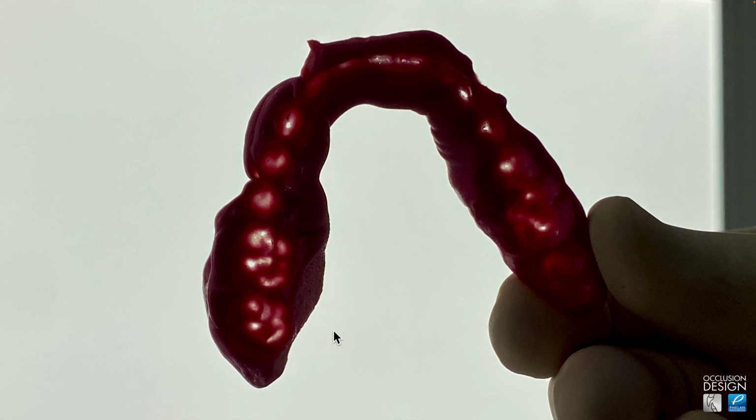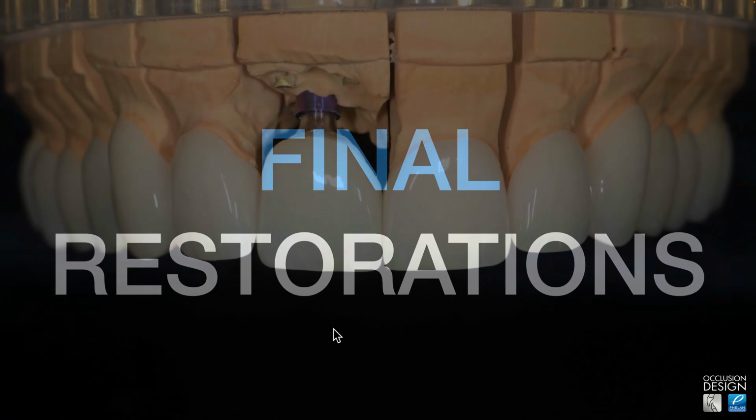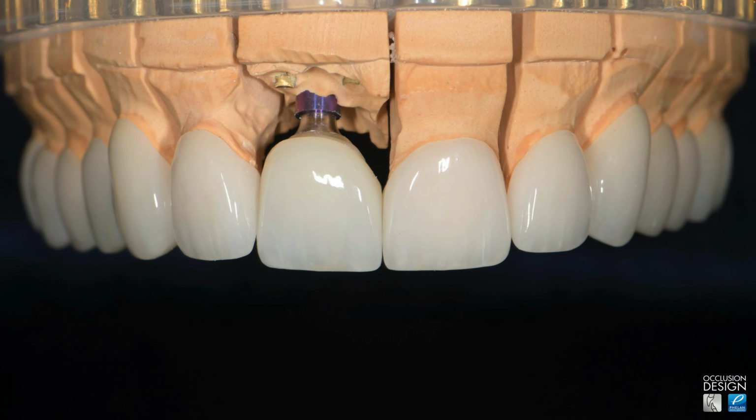You can see the contacts. And then the final restorations, as I said, we created the uppers first. This was a challenge on the upper because we had to make a custom impression, a custom abutment and post and cemented crown. So I couldn't do a fully screw retained cemented crown. The hole was going to come out around here somewhere.